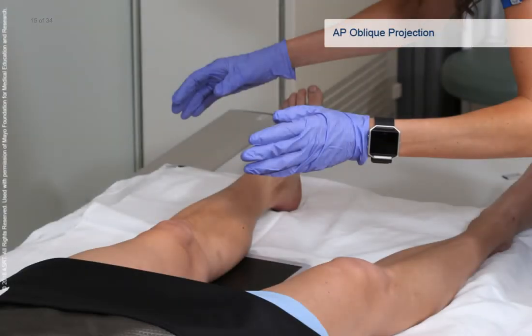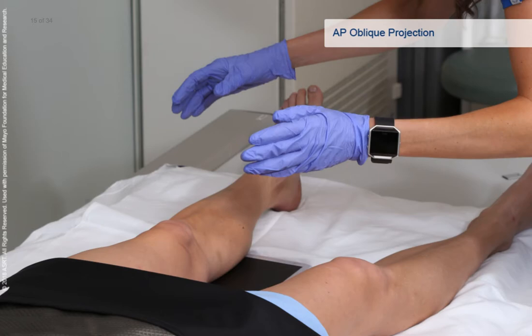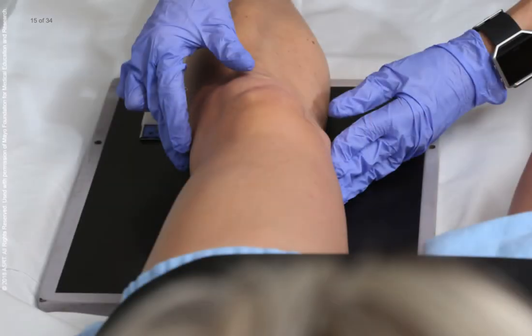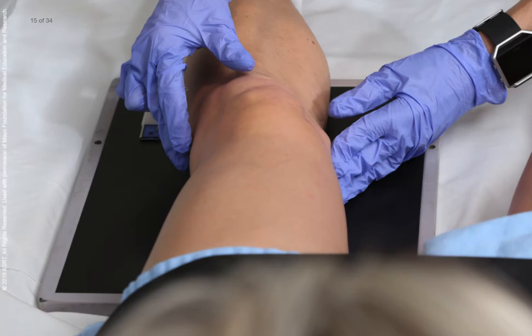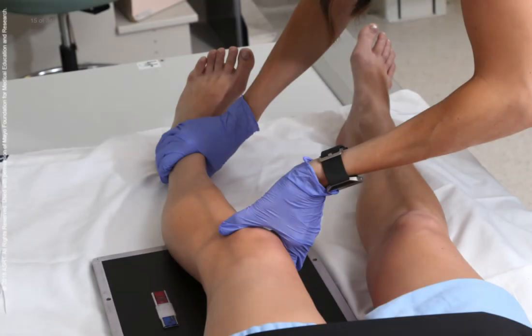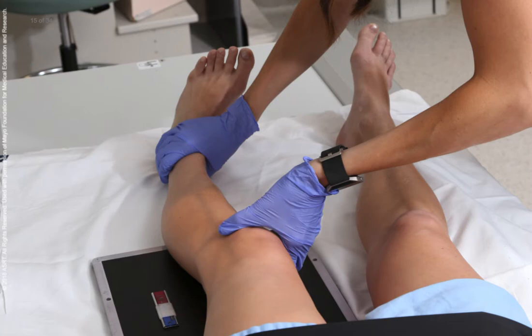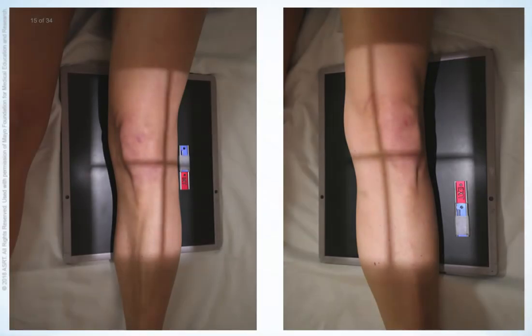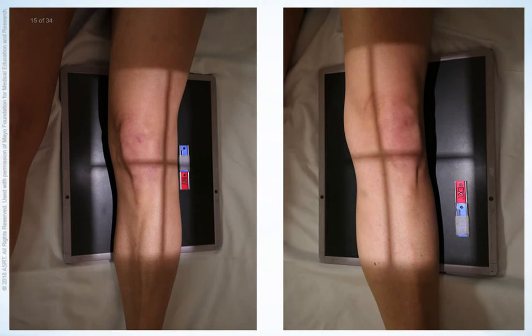Positioning for a lateral or medial AP oblique projection begins with the patient supine with the leg extended and positioned as for a standard AP projection. The image receptor is centered to the knee joint approximately half inch or 1.3 cm below the patellar apex. To position the knee for the lateral oblique projection, rotate the patient's leg 45 degrees externally. If needed, use a positioning sponge to elevate the hip and leg of the unaffected side. To position the knee for the medial oblique projection, rotate the patient's leg 45 degrees internally. If needed, use a positioning sponge to elevate the hip of the affected side. For both oblique projections, the central ray is directed to the knee joint and enters at a point half inch inferior to the apex of the patella.